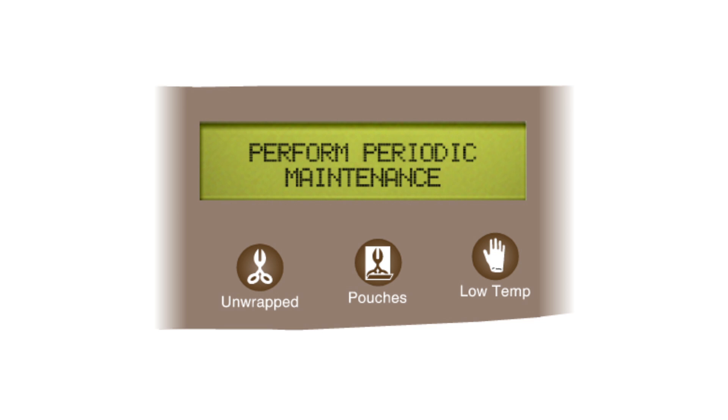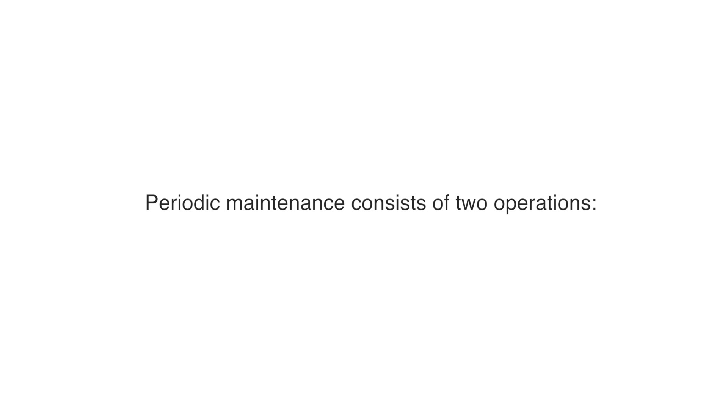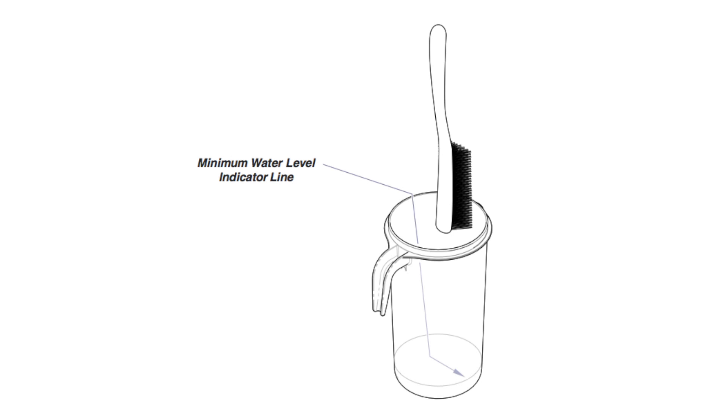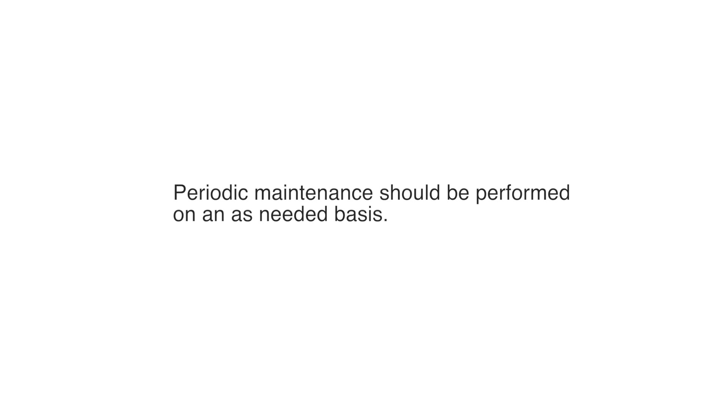Every seven days, the autoclave will automatically display a message stating 'Perform Periodic Maintenance.' Periodic maintenance consists of two operations: changing the water in the unit and cleaning the external condensing tank. Periodic maintenance should be performed on an as-needed basis.